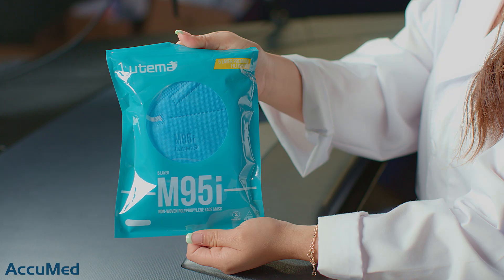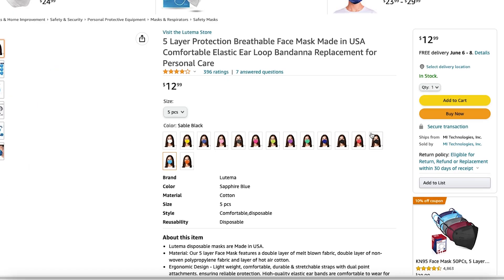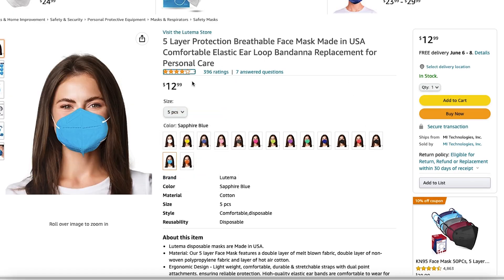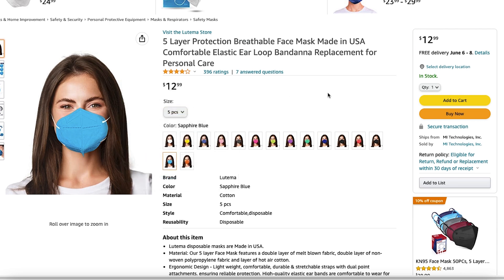Hello everyone and welcome back to the Acumet channel. Today we're going to be testing and reviewing the Lutema M95 eye mask. According to the listing, these are a five layer mask and are made in the USA. We ordered the five pack which cost $12.99, making them roughly around $2.60 each. They do have a 4.2 out of 5 rating with 396 reviews.